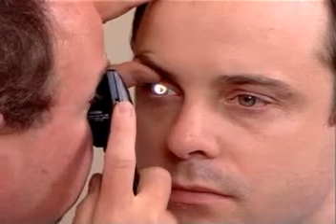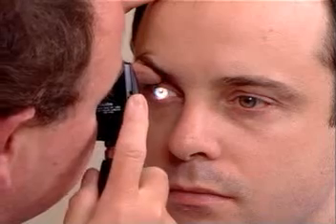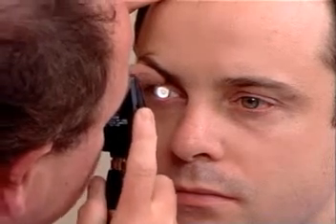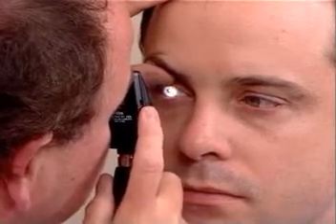First visualize superior nasal, inferior nasal, inferior temporal, and superior temporal. And Mr. Johnson, please look at the light. And at that last second, the patient's macula has looked directly at the light, and one is looking then at the fovea of the macula.